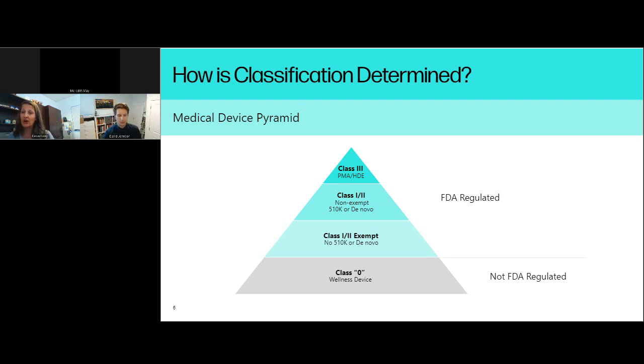So anyone that's on this call, if you are not part of ASTM, I would strongly consider becoming part of ASTM. F42 is the additive manufacturer group. And so it's looking at all industries with additive manufacturing. But that's where we're talking about what is the lot release criteria and what defines the size of a lot and what are the criteria around a company, a manufacturing engineer or company deciding, okay, this is what we're going to test. And that's where we'll test chemical, metallurgical, powder will become part of the process.